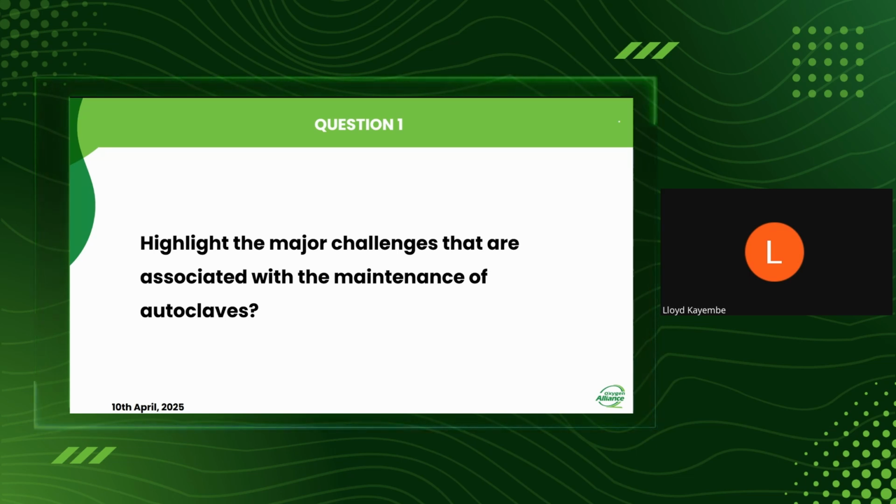You find that most of the heating elements don't work for long, which leads to the elements being blown out. That's one of the major challenges I have experienced with autoclaves in general. I don't know what other people have experienced with these autoclaves as a challenge.